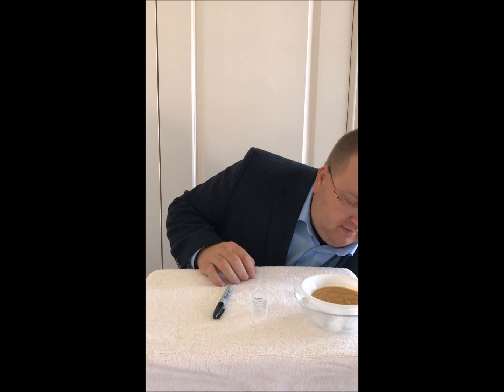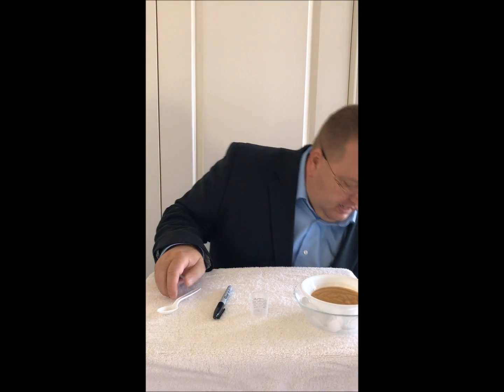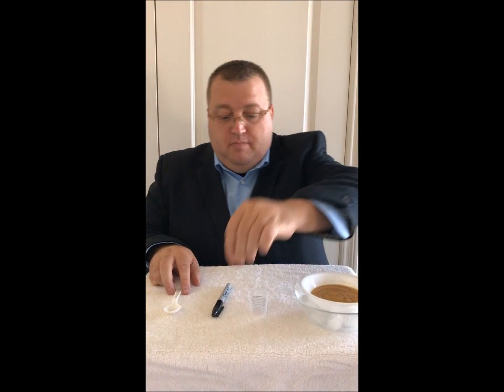So we'll assume they're doing it correctly. Also, we're going to need a cup. We're going to need a marker. We need, of course, the spoon, and not the least of which is the medication itself, whether it's one or more pills. Now, many times the pills are kept in a blister pack just below the top of the table in a drawer so that they're safe and kept locked away from other people.